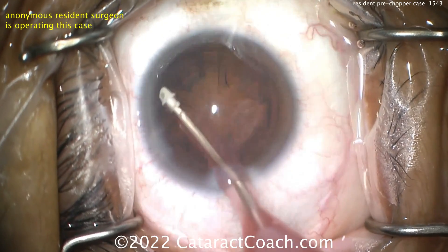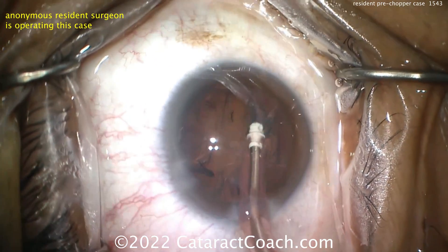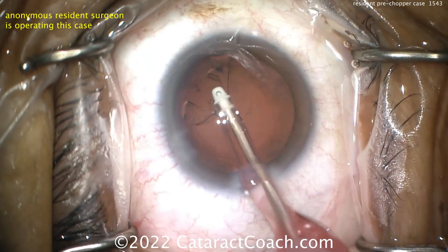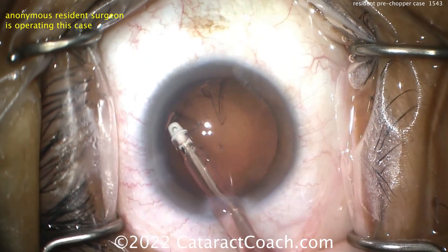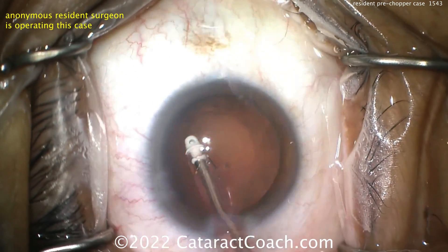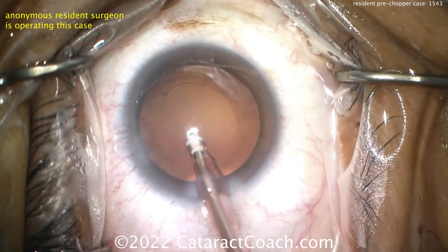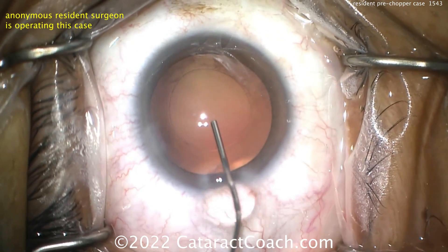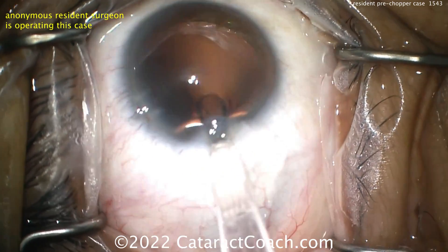There are cases where pre-chop is more challenging — specifically where you have greater nuclear density. With a dense nucleus, you'll have a harder time getting the paddles of the pre-chopper to penetrate. You may need a second instrument like a nucleus sustainer — essentially a hook or chopper to hold the equator of the lens nucleus — so you have more holding force when placing that paddle. Otherwise, with a dense nucleus, you won't be able to fully place the pre-chopper deep enough.